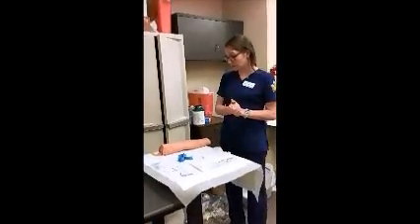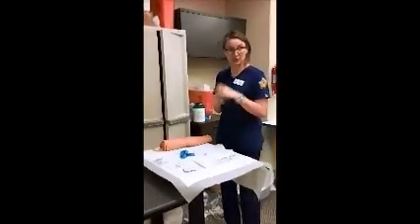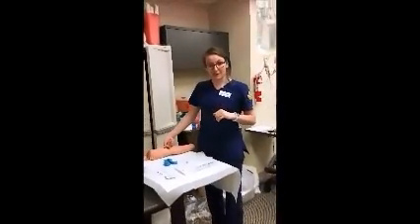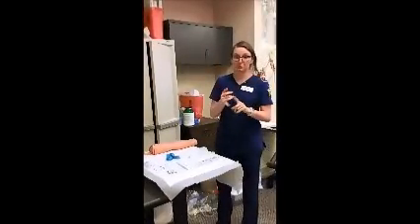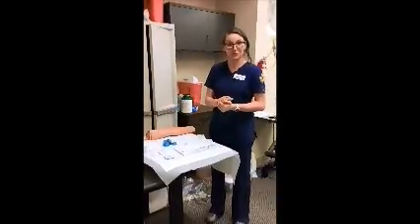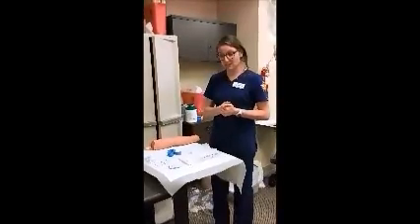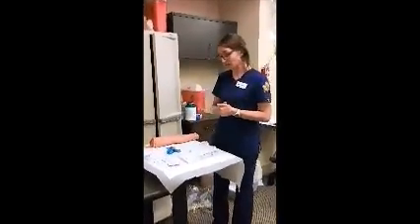So I would first start off by introducing myself to the patient, because we're going to go ahead and perform this IV infusion and access a peripheral IV catheter. I would enter the patient's room, perform hand hygiene, ensure patient privacy, check patient safety measures and staff safety measures, raising the bed if I needed it. I usually don't. I would ask the patient what their name and date of birth is. He is Joe Schmo. Date of birth is 3/22 of 78.